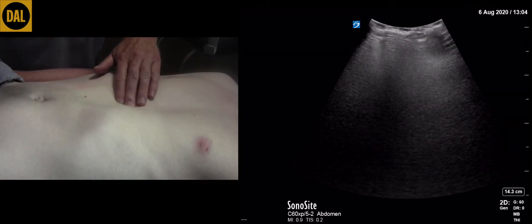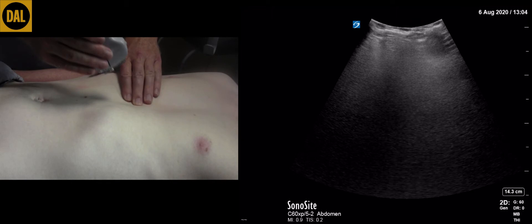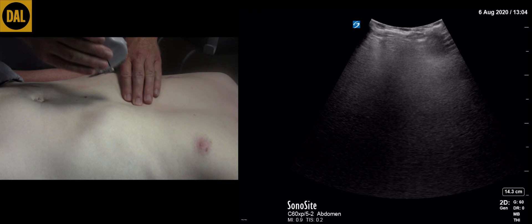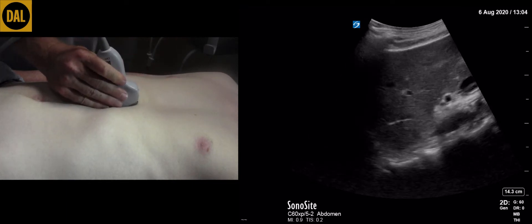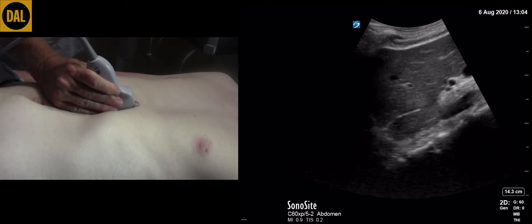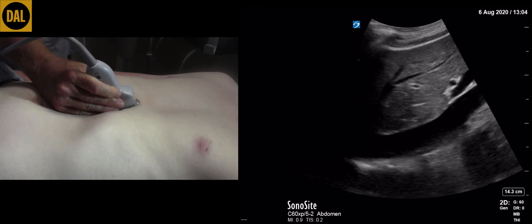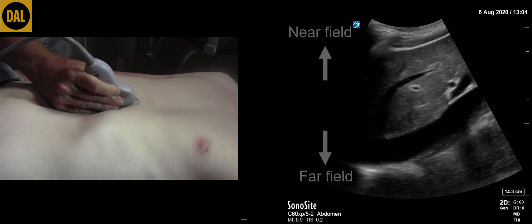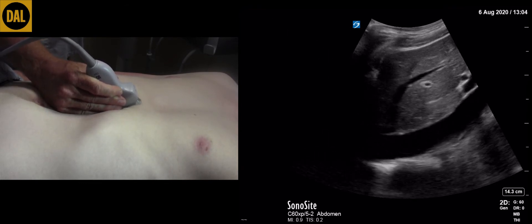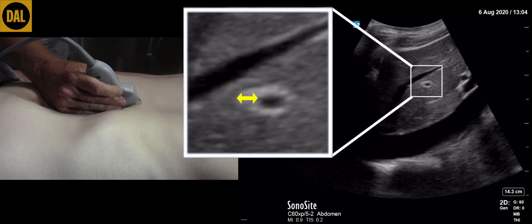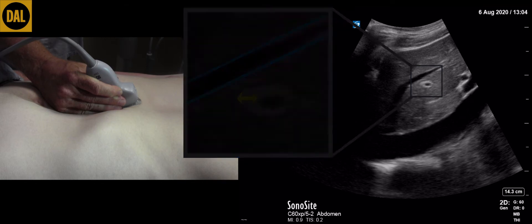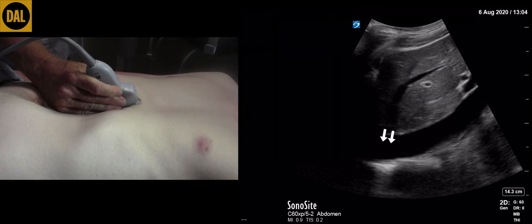The transducer is in the longitudinal plane. The direction marker on the transducer corresponds with that on the screen and indicates a cranial direction. Place the transducer in the sub-xiphoid space, then rock the transducer cranially by approximately 20 degrees. The liver will be visualized in the near field. Within the liver, two vascular structures can be visualized. The portal vein has a bright echogenic wall and the hepatic vein has no appreciable wall. The hepatic veins can be seen draining into the IVC.